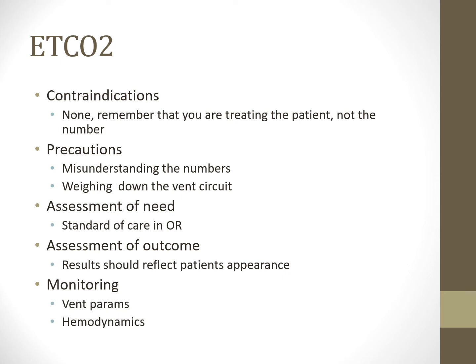So monitoring, ventilator parameters, and hemodynamics. Hemodynamics, huge thing, especially with critical care, especially with positive pressure ventilation. Hemodynamics and end-tidal CO2 are best friends there. Vent parameters there too, but I am a huge fan of hemodynamics.